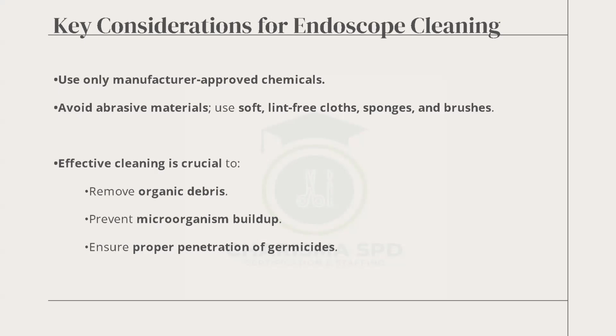Intent is to clean, but the act of cleaning is bad. That's what I mean. So effective cleaning is crucial to remove organic debris, prevent microorganism buildup, and allow proper penetration of what? Germicides. Okay. If you want to do it, you remove the debris. That's why point of use is done.